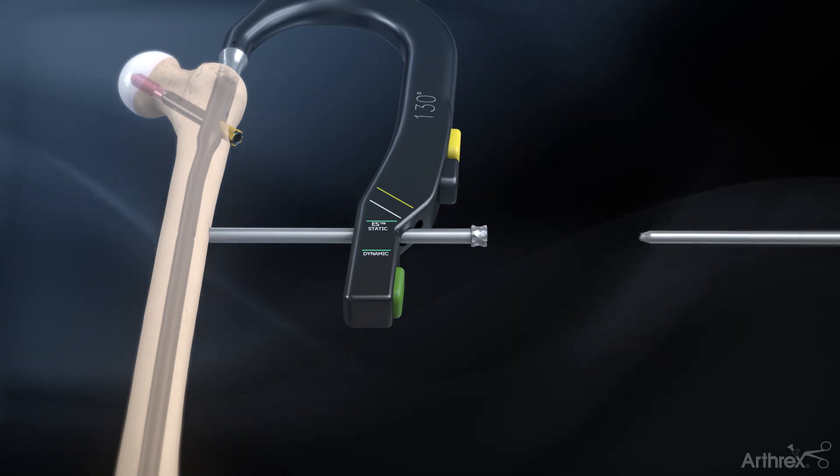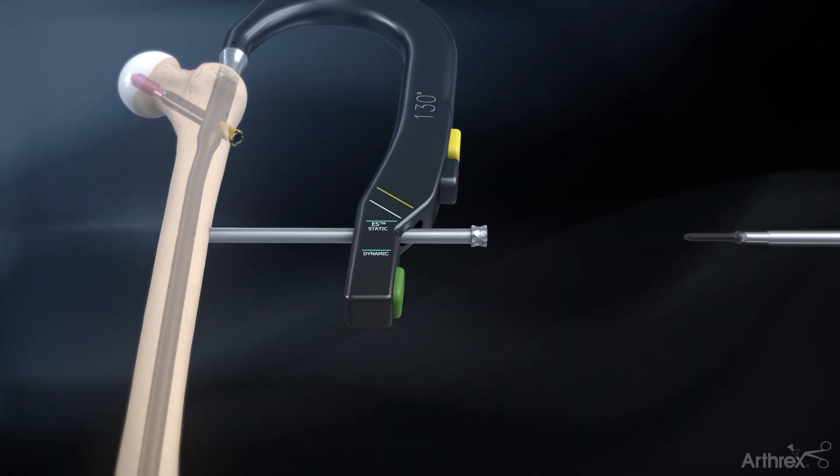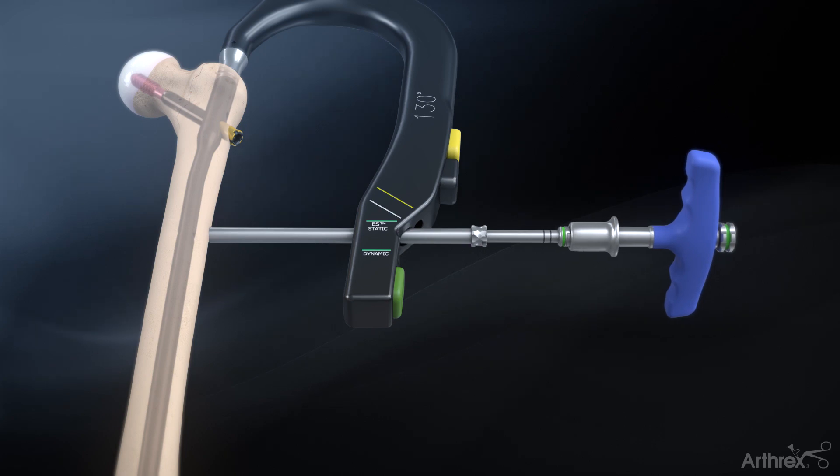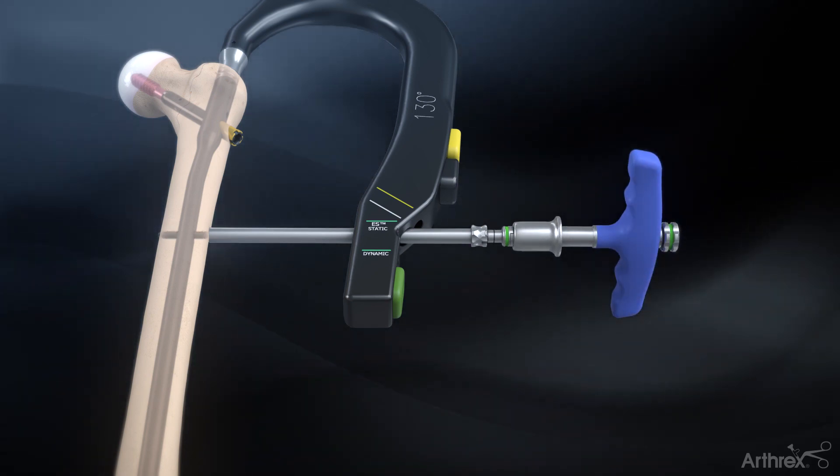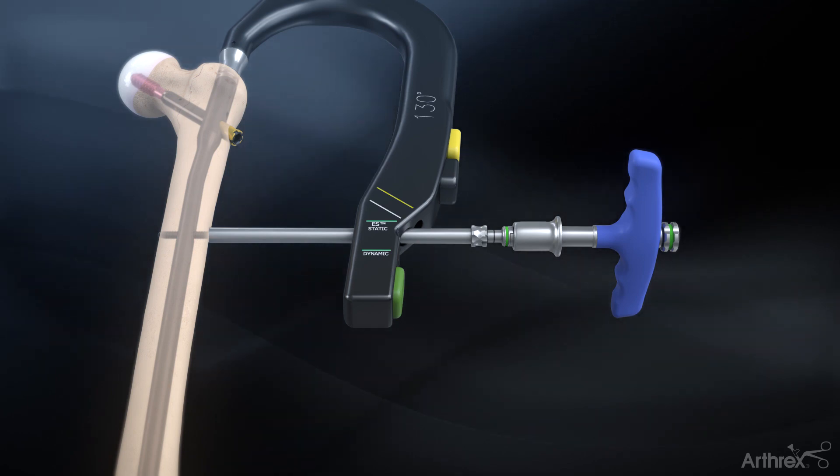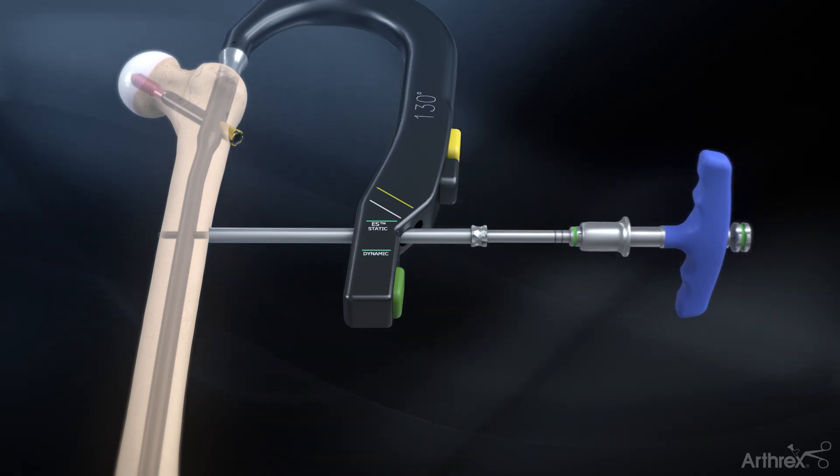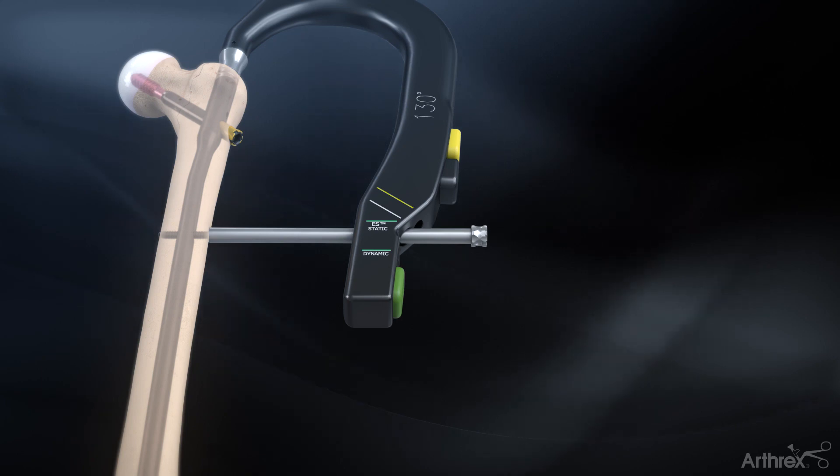Remove the distal drill guide and insert the 5.0 mm captured screw with the 5.0 mm hex driver. When the first laser mark reaches the sheath, the bottom of the screw head has reached the other end of the sheath. Unscrew the capturing rod in the hex driver and remove the driver assembly.